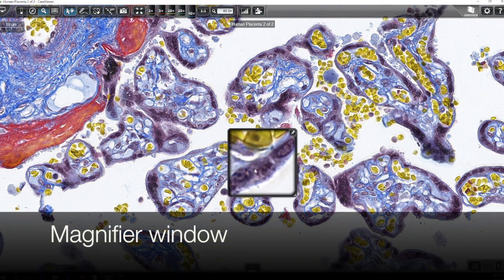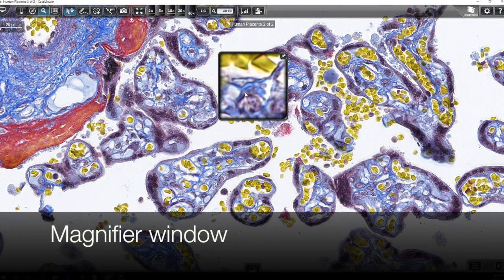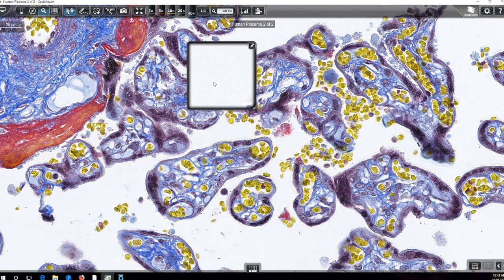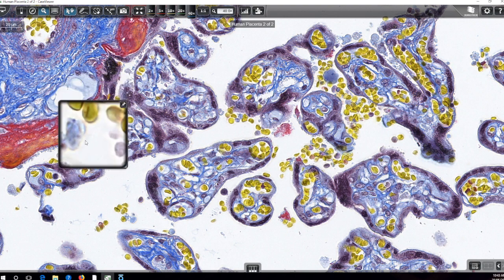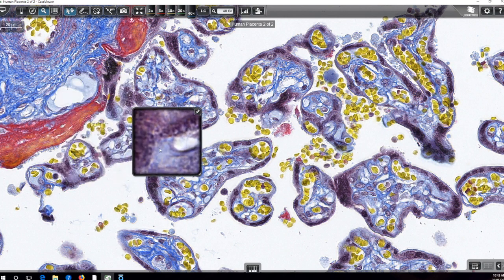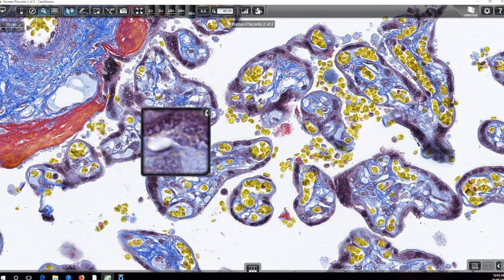There's also this convenient magnifier window that by moving that around, you can put it on top of an area of interest and just look at some of those details at a higher magnification.